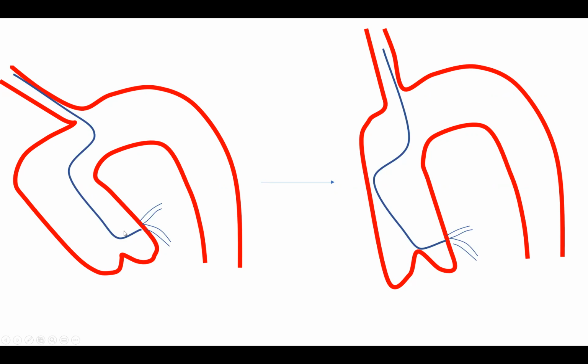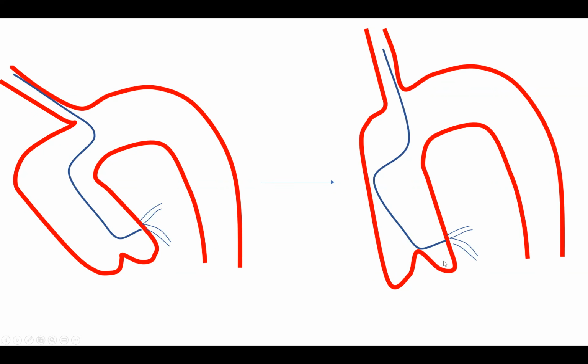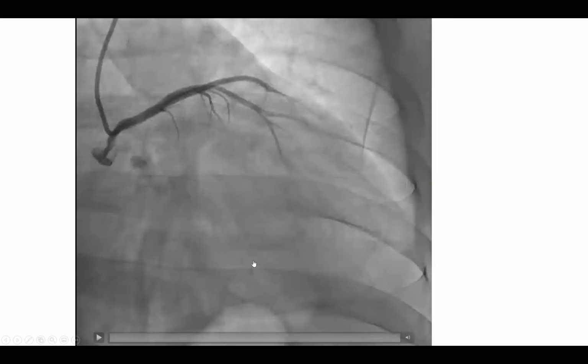Okay, those catheters tend to be unstable, and taking deep breath can make them fly out and prolapse in the ascending aorta. So that's why it doesn't always work. Or if you engage it while the patient is taking deep breath, then when he exhales, your catheter may fly out. So that's one problem, keep in mind, with using deep breath. But that's a technique. Understand that anatomy. So deep breath can work, or deep exhalation if you want to go into the circumflex.